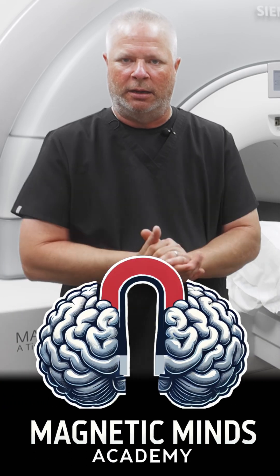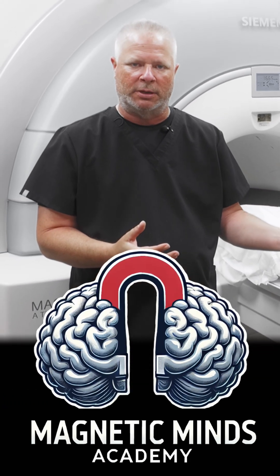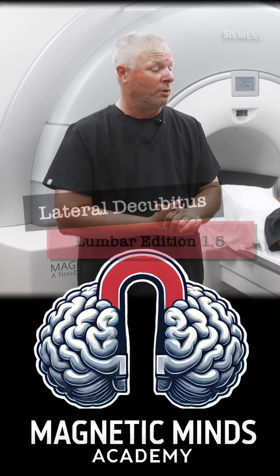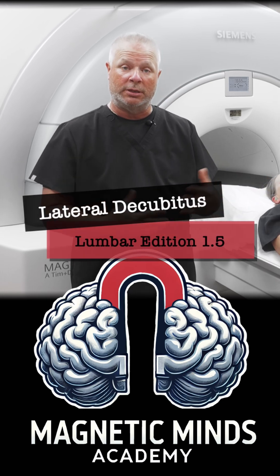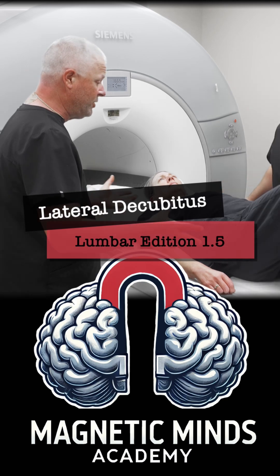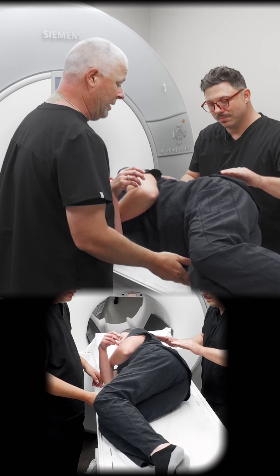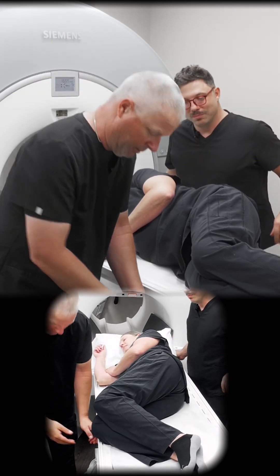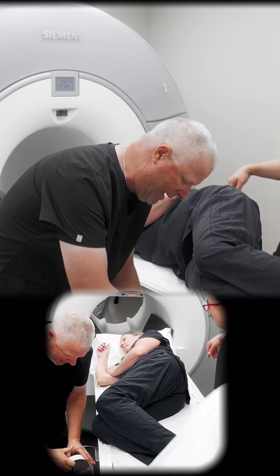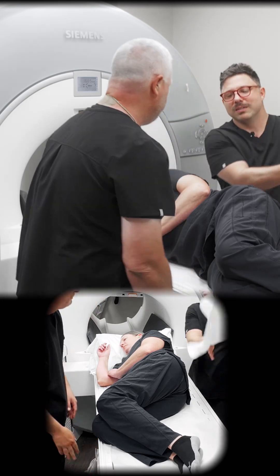Hi everybody, we are back. When we first started setting up the routine lumbar spine, we want to show you guys other ways that you can do lumbar spines. We're going to do this with the patient on their side and show you guys how to set that up. We're gonna have the patient lay on their side, and there are gonna be quite a few times where patients are not gonna be able to lay flat on their back or their side, so we're going to show you what to do in those cases.